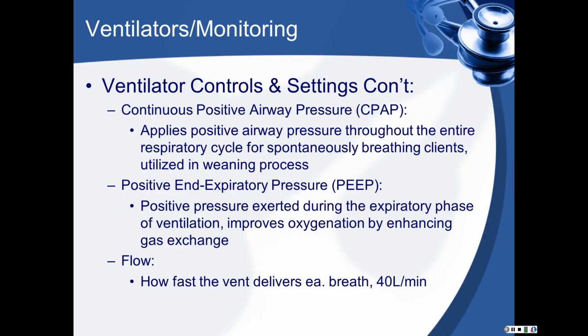So maybe it is that you need to increase the flow rate, and that should be tried before initiating any further usage, possibly restraints or whatever like that. So it may be that your patient is experiencing air hunger because the flow rate is too low, and that just needs to be increased a little bit.